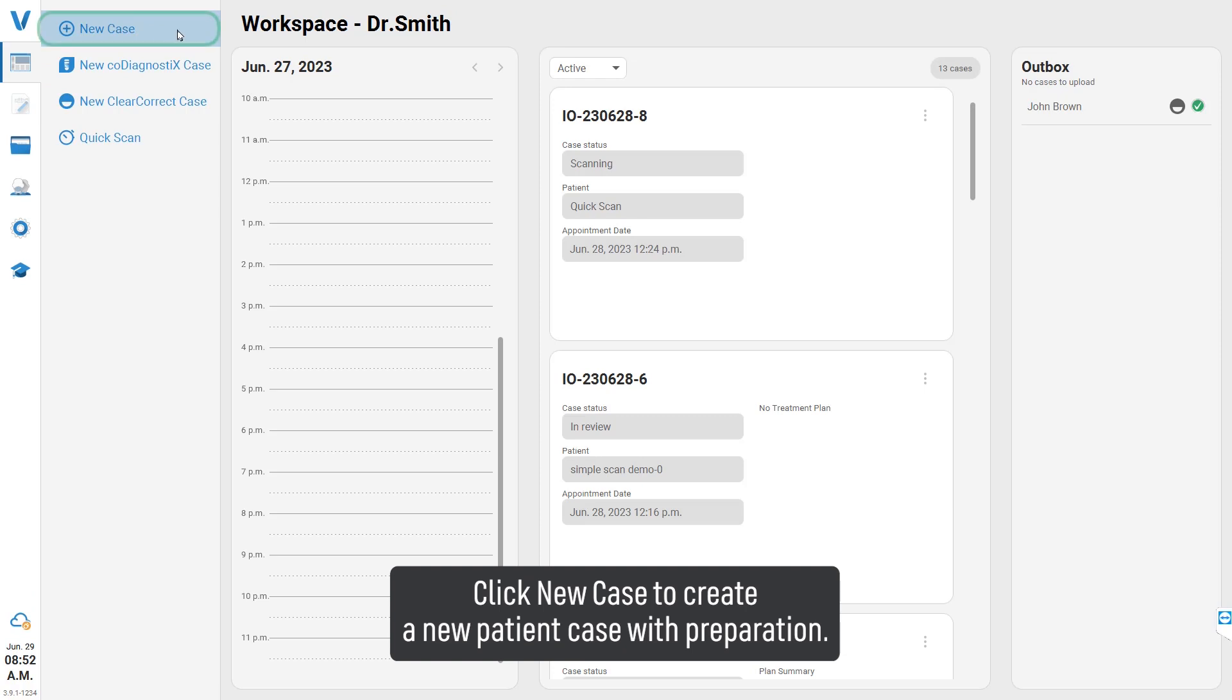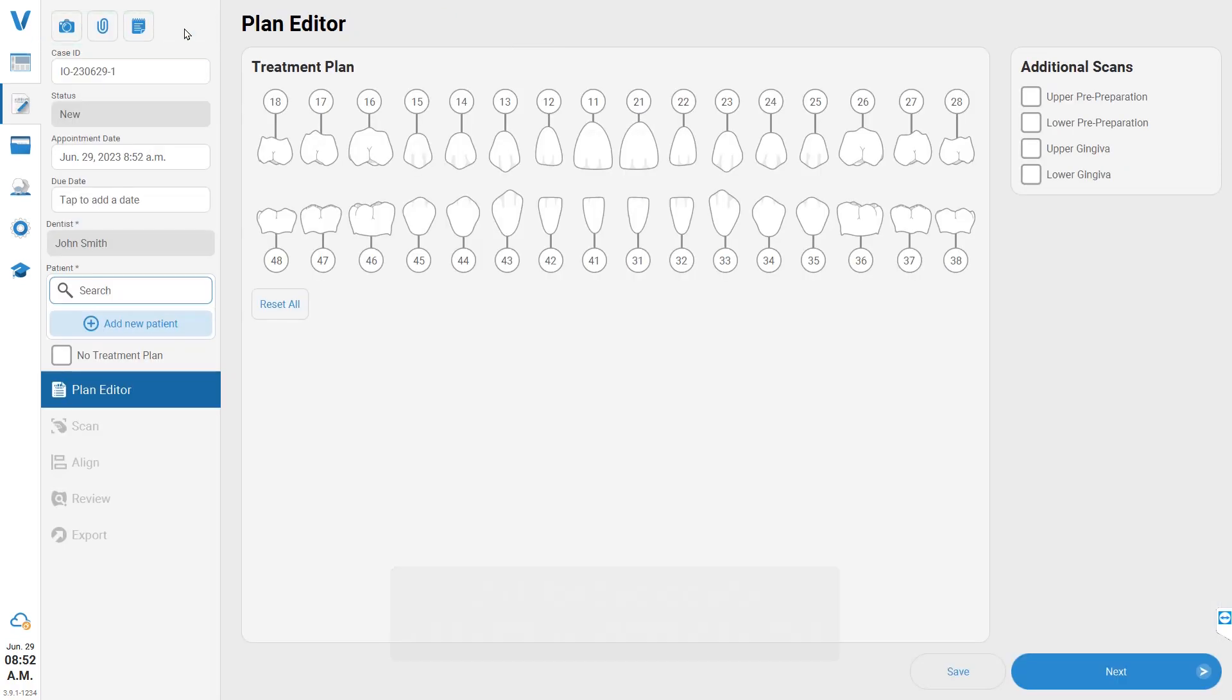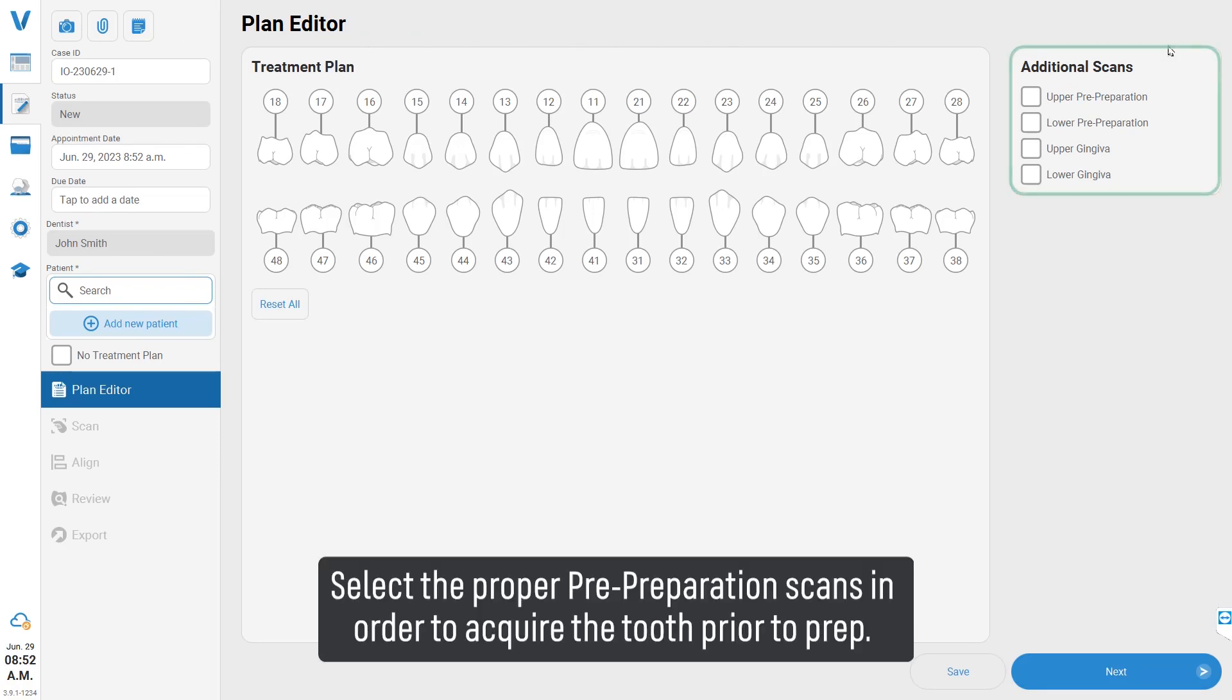Click 'New Case' to create a new patient case with preparation. Select the proper pre-preparation scans in order to acquire the tooth prior to prep.